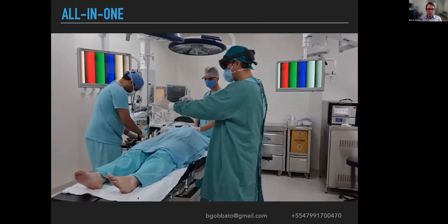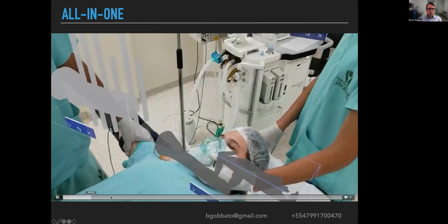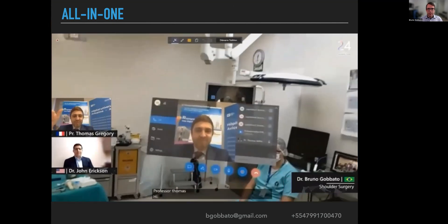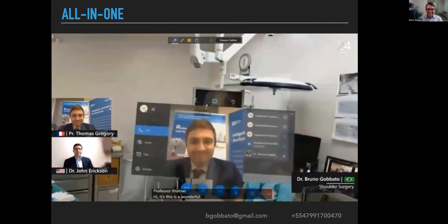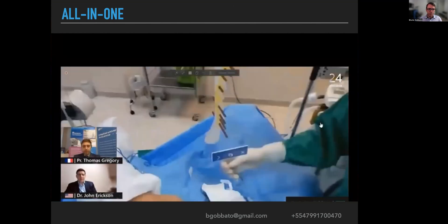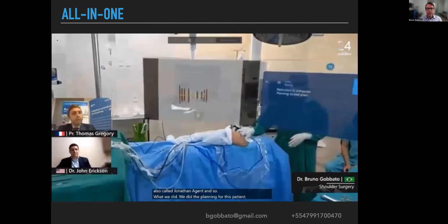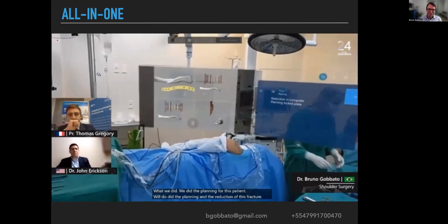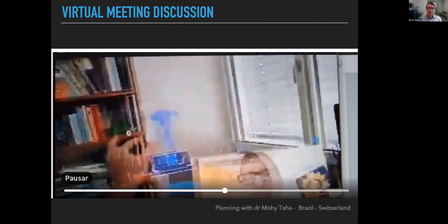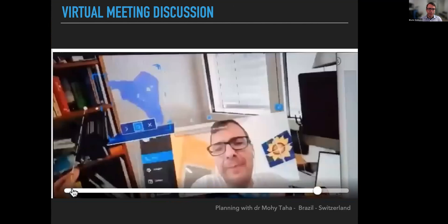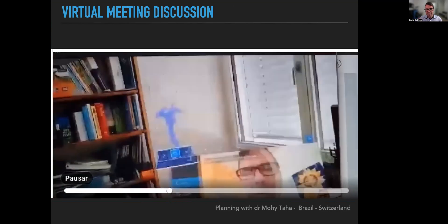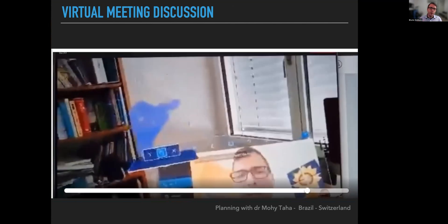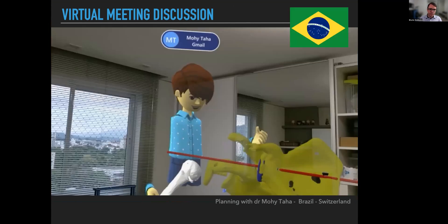This is how we do it: this is me with the glasses, we project the models, and during the surgery we can also have the aid of other surgeons. This is surgeon Thomas Gregory from France and Thomas Erickson — they are seeing everything that I see from my field of view, and I can see them. We are performing the surgery with two hands but three heads. This is me and Dr. Mori Taha from Switzerland planning a surgery together — Dr. Mori is using the glasses, this is the glenoid, and I'm seeing his field of view as we discuss how to perform and plan a reverse total shoulder arthroplasty.